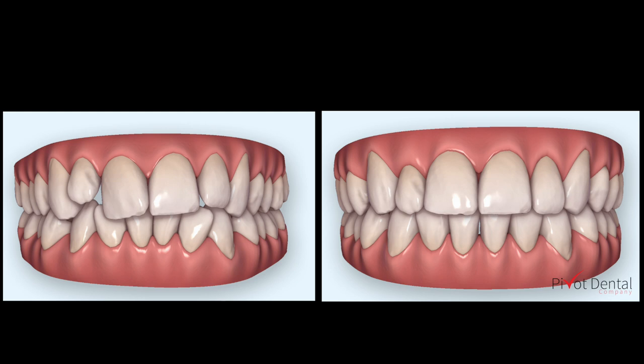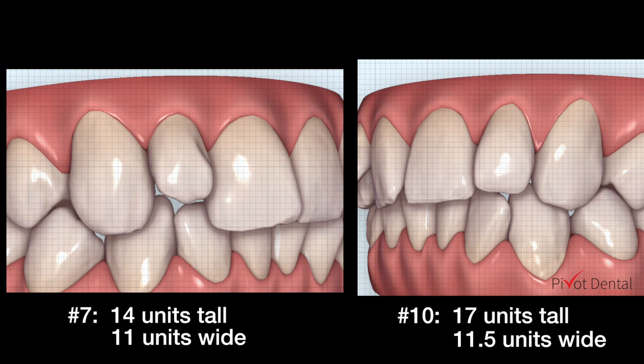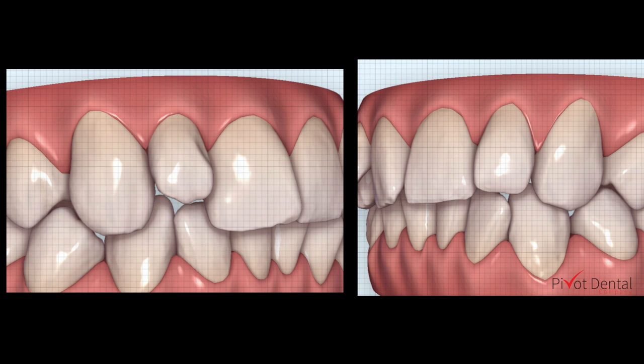You can see in this side-by-side photo the beginning set of teeth and then the end of treatment — that's where he would wind up after all 23 trays. If we turn the models and put the grid feature on, you can see that tooth number 7 is smaller than tooth number 10. Measuring in units, number 7 is 14 units tall compared to number 10, which is 17 units tall. The width is very similar, just off by about half a unit.